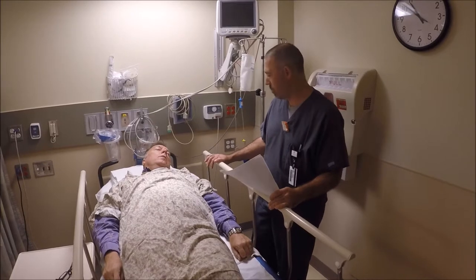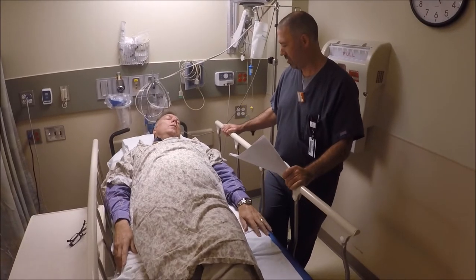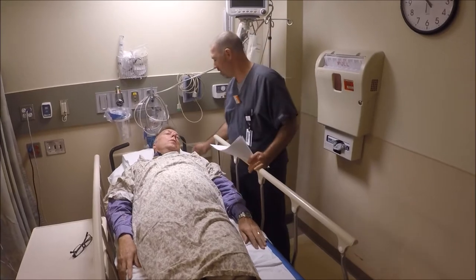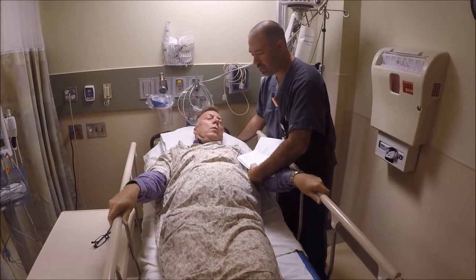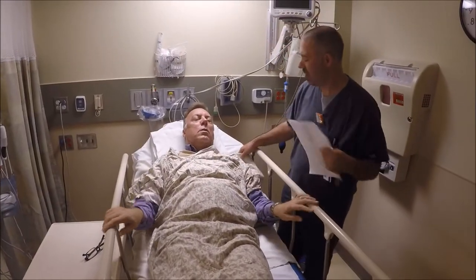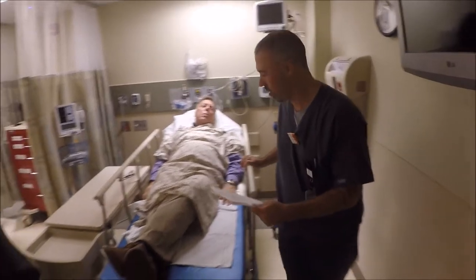Looks like the bed's at a pretty good height. I'm going to come down just a little bit. I'm going to set your head up just a little bit higher here. That's going to help us out and give us a little better X-ray. If you can bend just a little bit, that might help a little bit. That looks pretty good there with our height. I'm going to go ahead and get the X-ray set ready and then I'll let you know before we put that in there.